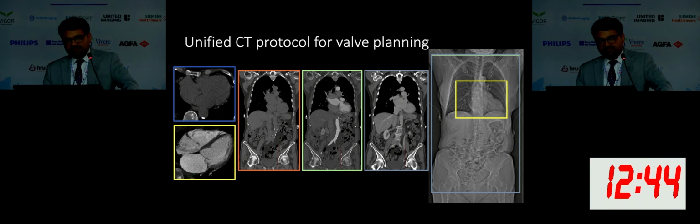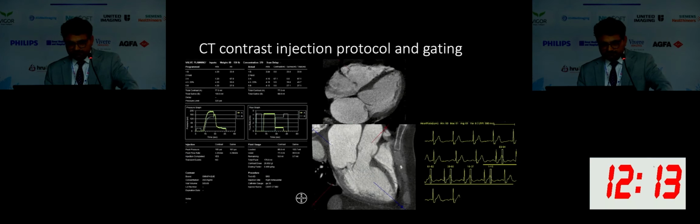The rationale is that sometimes the same patient has more than one procedure done, and also having different protocols disrupts the workflow. Sometimes the indication is wrong, and then you have to do it all over again. The only problem with this protocol is radiation dose, which is in excess of 10 millisievert of median dose. But these are usually older individuals, and radiation is not that much of a concern.